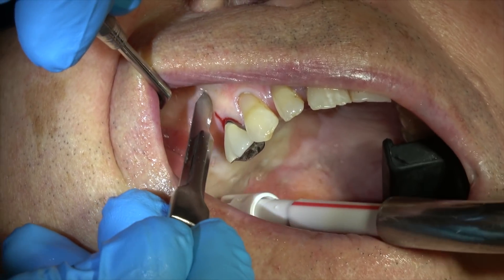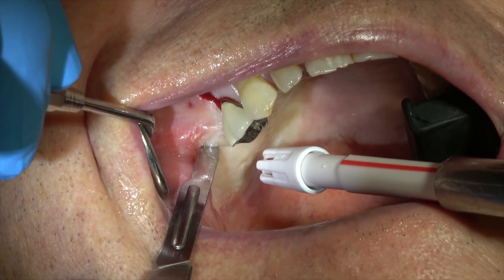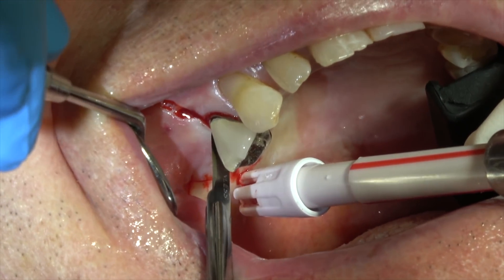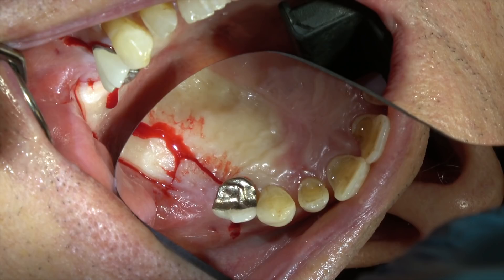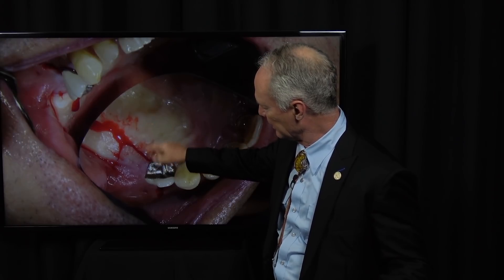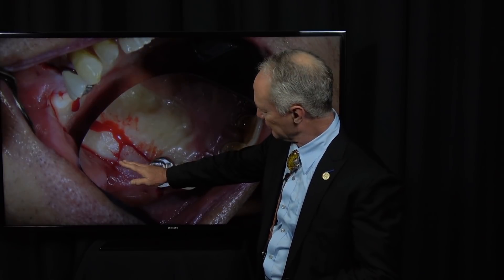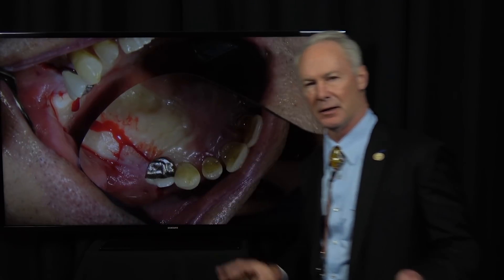This is a releasing incision into the non-keratinized or unattached gingiva, and this is the distal releasing incision. You can see the line between the attached and the unattached gingiva. I'm extending the incision into the unattached non-keratinized gingiva, cutting into the sulcus on the distal of the first bicuspid. See where I've made this mesial-to-distal incision on the palatal side of the implant placement site — I'm going to reflect the entire flap this way.